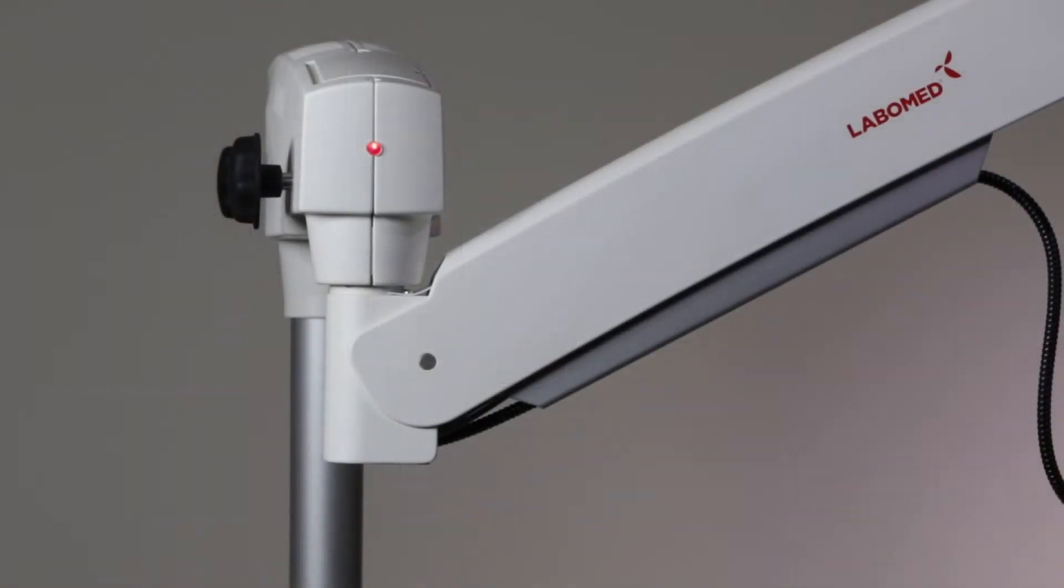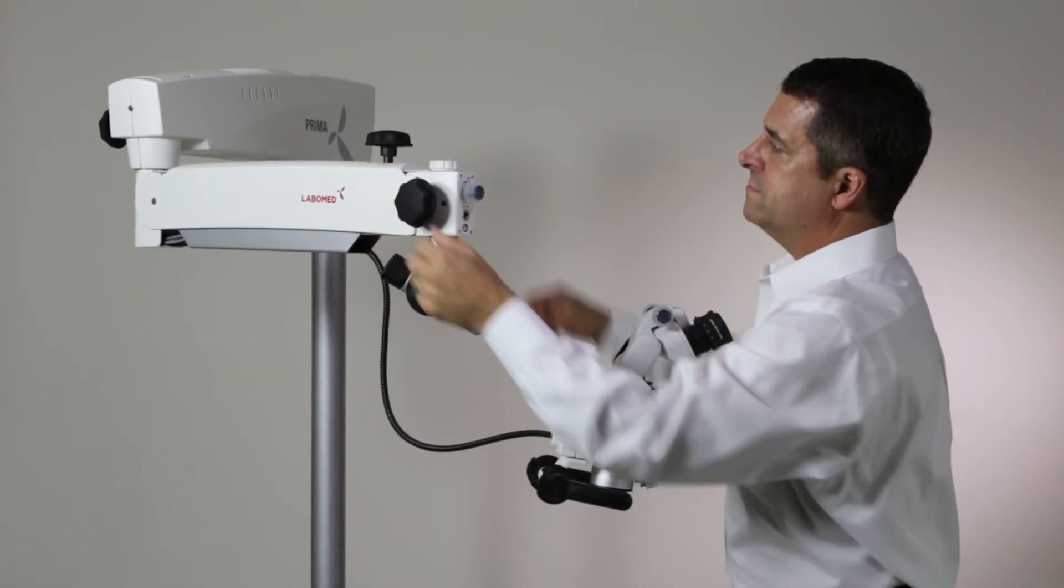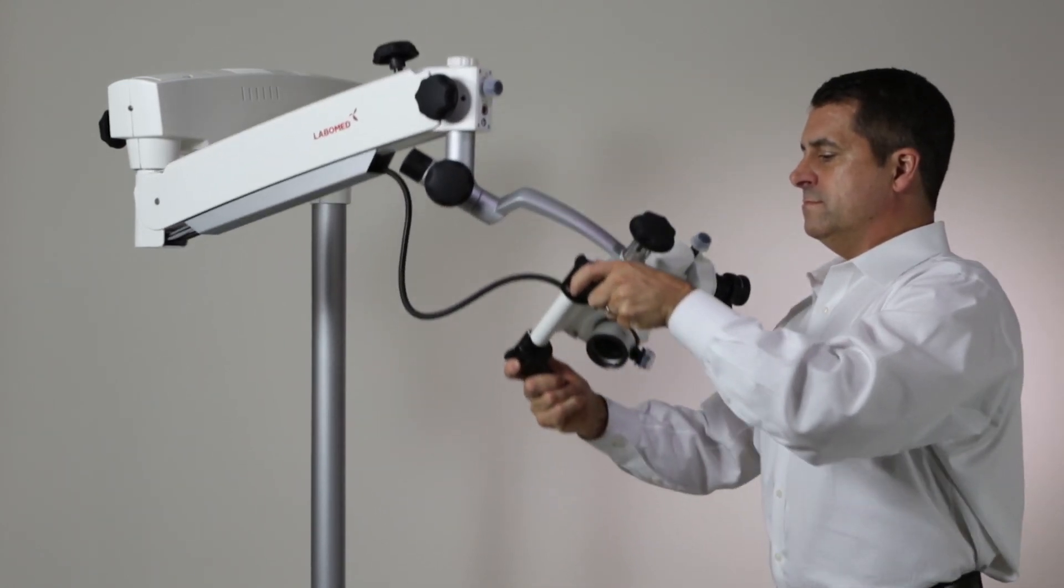Move the microscope downward to take it out of the park position. Loosen all the locking knobs and test all points of articulation, ensuring there are no obstructions.